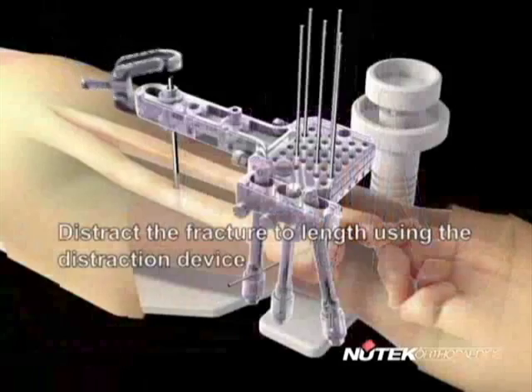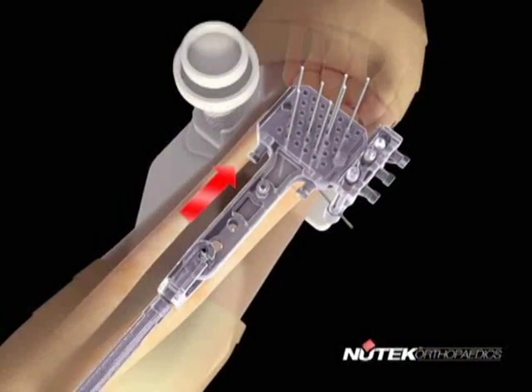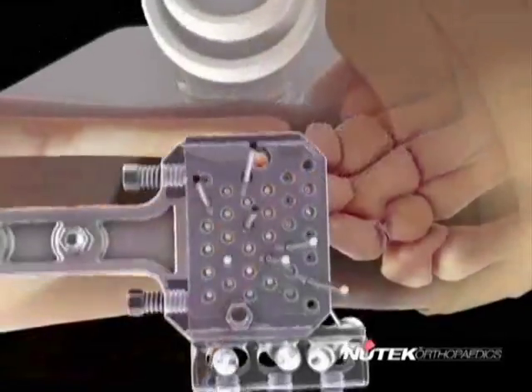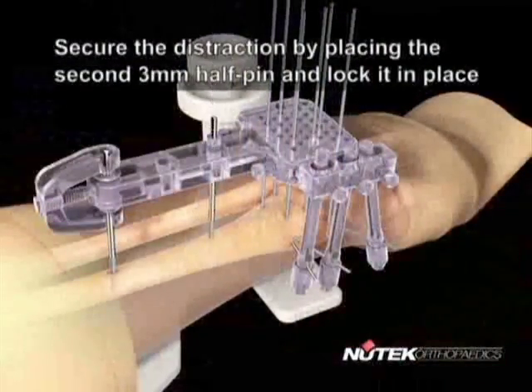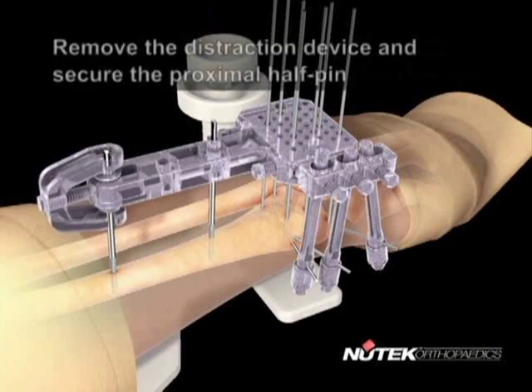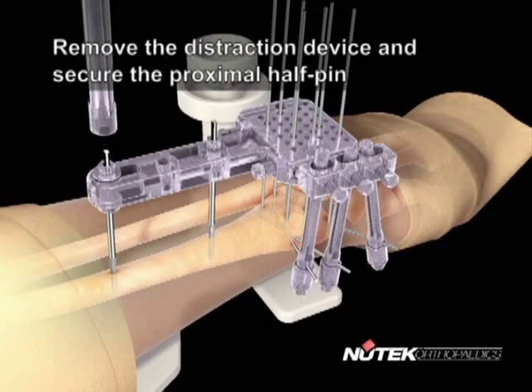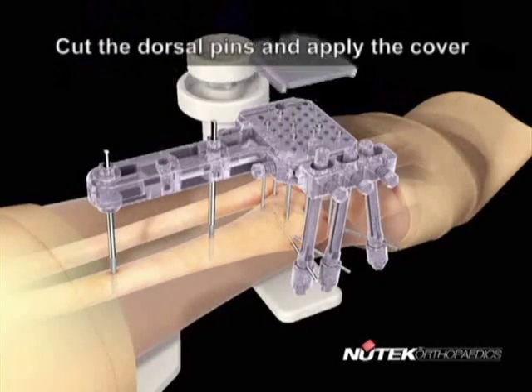Distract the fracture to length using the distraction device. Secure the distraction by placing the second 3 mm half pin and locking it in place. Remove the distraction device and secure the proximal half pin. Cut the dorsal pins and apply the cover.